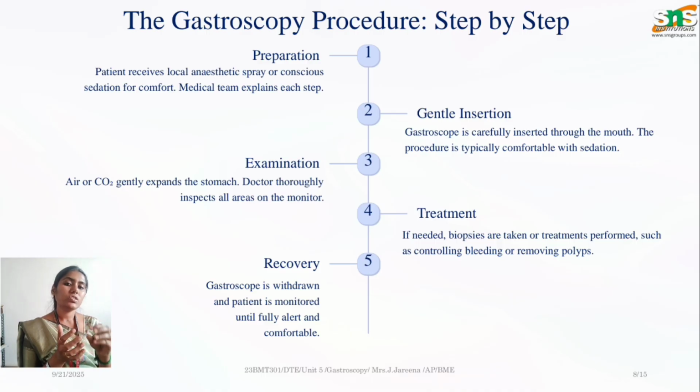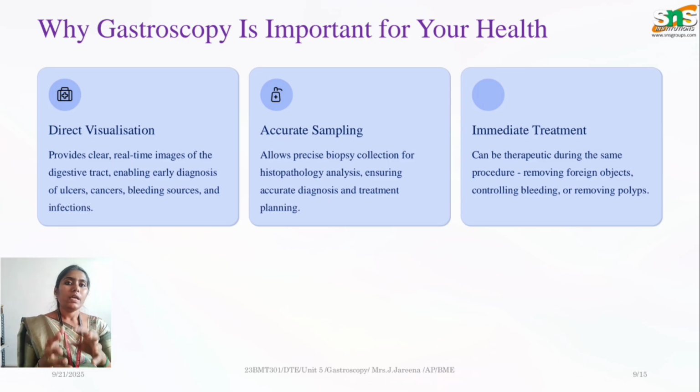After that, the patient is monitored for any discomfort for 1 or 2 hours, and once everything is fine, we will send them back home. The patients can also carry out their daily activities without any trouble. So this is a 1 day procedure or 1 day treatment. This is how gastroscopy stands as a leading procedure in diagnosing problems. Yes, that is how gastroscopy works.